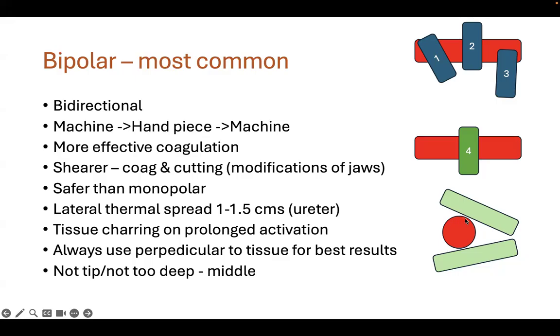So if you see this figure, when bipolar energy is applied to the tissue, the coagulation starts happening at the outsides first. When this outside area gets coagulated first, resistance increases again because water is the only one which has resistance in the tissue. So when this gets coagulated or denatured, resistance first increases on the external surface. And then it is a struggle for current to enter inside.